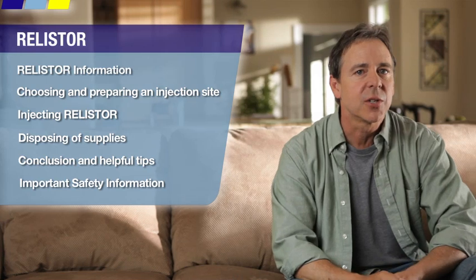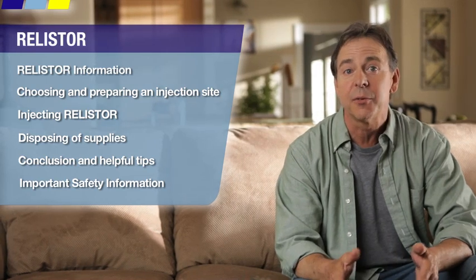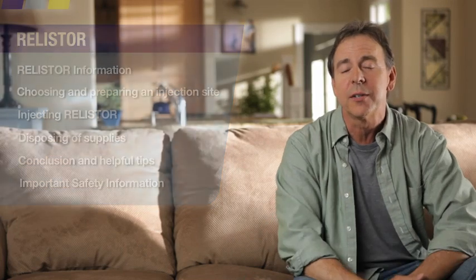Now, each section has its own title tab for you to use as a guide if you need to fast forward or rewind to replay a section. Now, once you learn the steps to injecting and you do it for a while, it should become easier for you to inject. If you're having any issues with taking Relistor, be sure to talk to your doctor or your nurse right away. Now, before you learn how to inject Relistor, let's talk about some information that's important for you to know about Relistor.